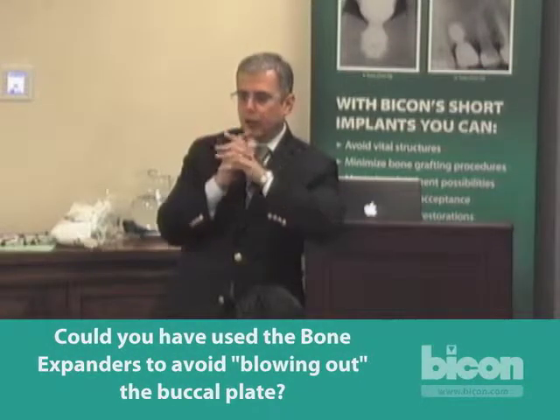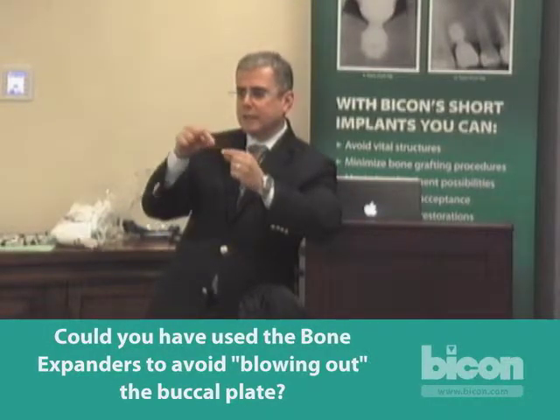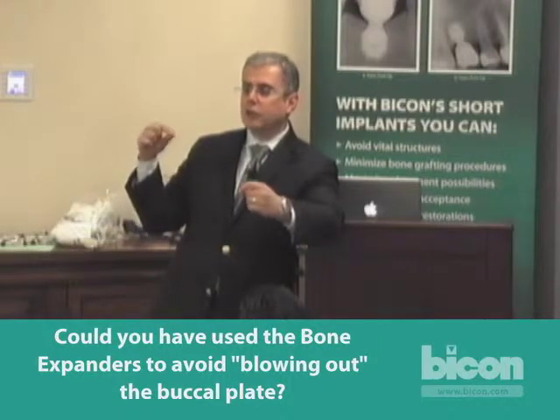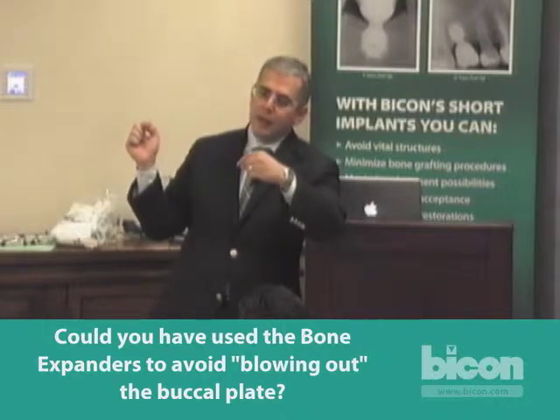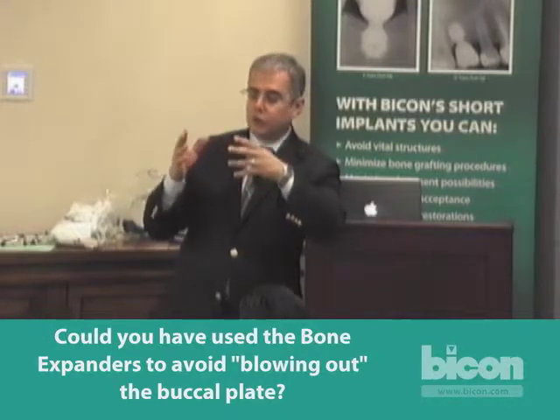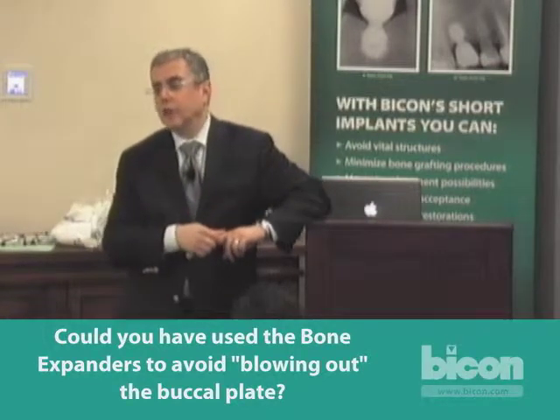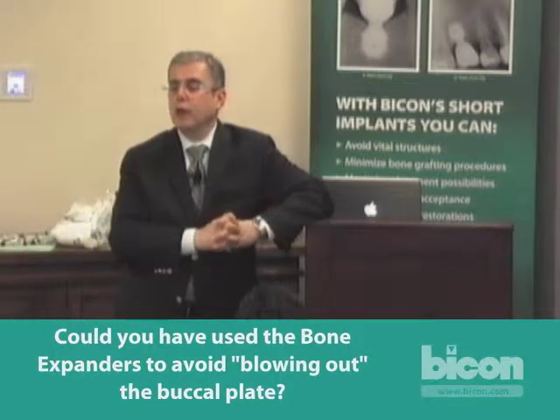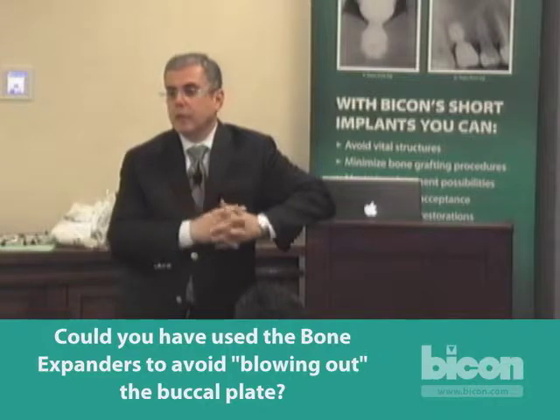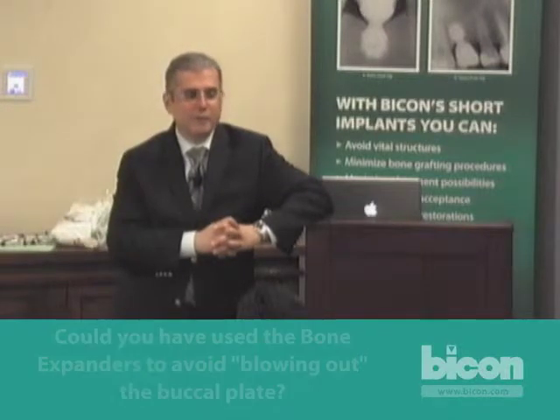It's a good thought, but from the very beginning, if you recall, I pointed out to you that there was a thin, straight scar, so there was no bone to dilate. There was a very thin, paper-thin amount of bone. Even with the pilot drill, which is only 2 millimeters, we were already seeing it. So it was that thin that it was translucent. If we were to dilate it, we wouldn't have saved anything because it would have burst right through at the height of contour on the buccal. So it wouldn't have saved us anything. It would have rattled the patient's skull, but not saved us the graft.